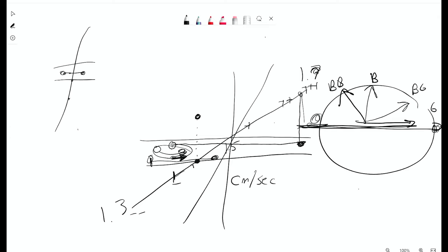And good old homie, aqueduct of Sylvius. Yeah, but that's typically what you're doing a CSF flow study for. Or in the spine, if you have a syrinx, you're trying to see where the flow is going at that point. Oh, I bet that looks interesting.